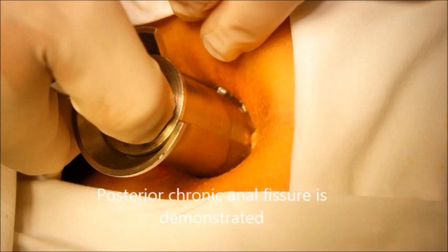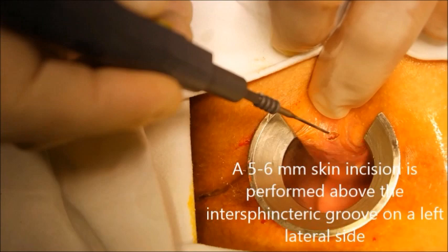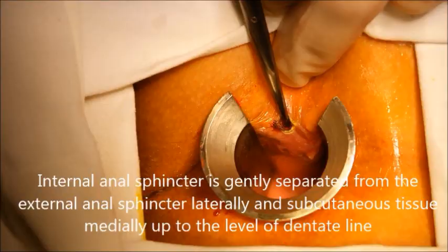Posterior chronic anal fissure is demonstrated. A 5-6 mm skin incision is performed above the intersphincteric groove on the left lateral side.